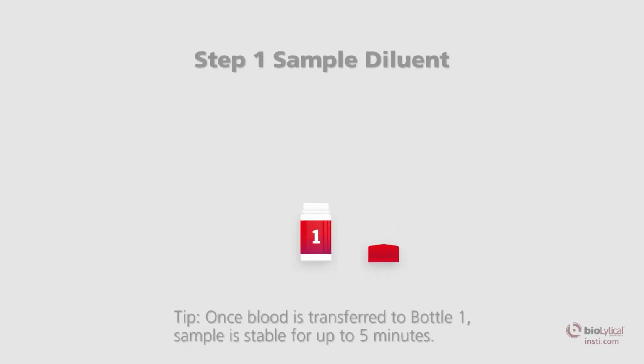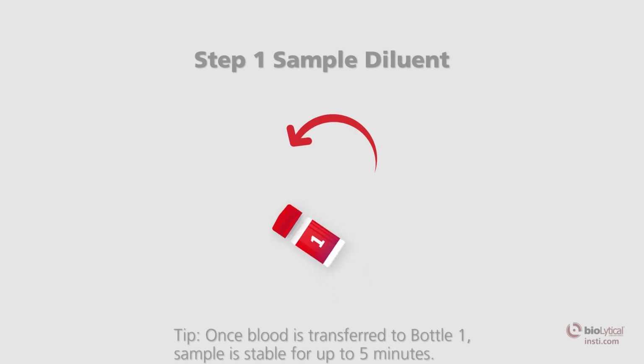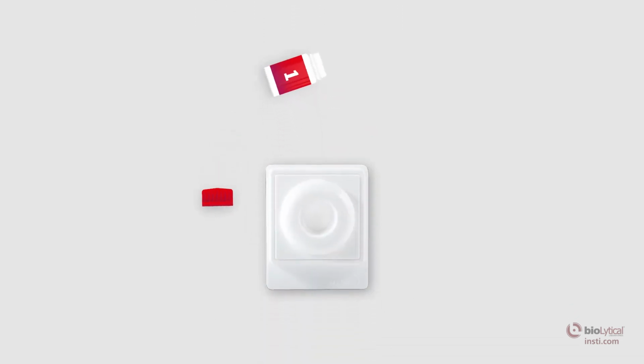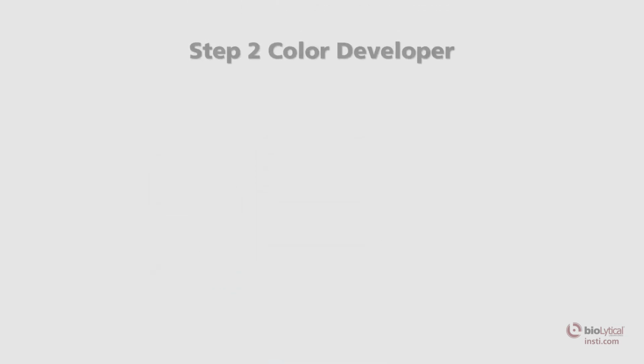Step number 1. Sample diluent. Once the sample has been transferred into bottle number 1, the sample diluent, recap the bottle and mix well by inversion. Open the sample diluent and pour the entire contents into the center of the membrane unit well. The sample should be absorbed quickly. Wait for all the liquid from bottle number 1 to be absorbed completely.